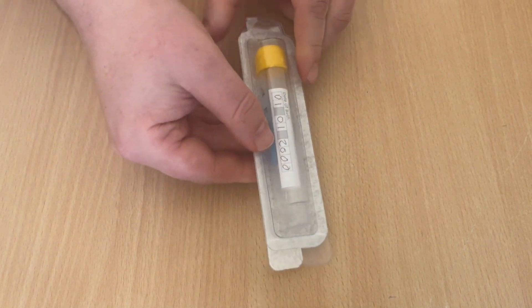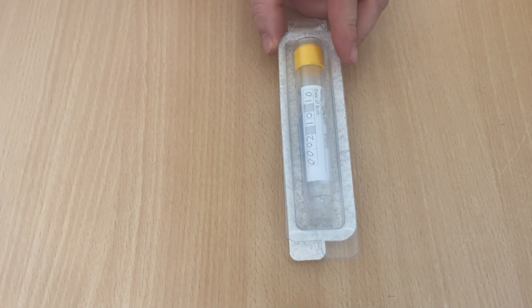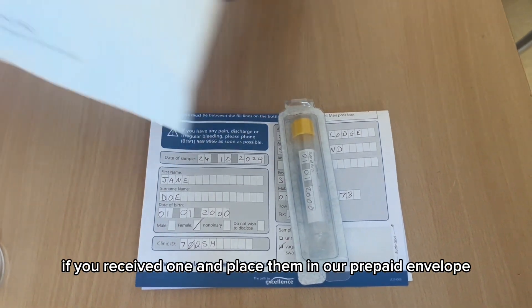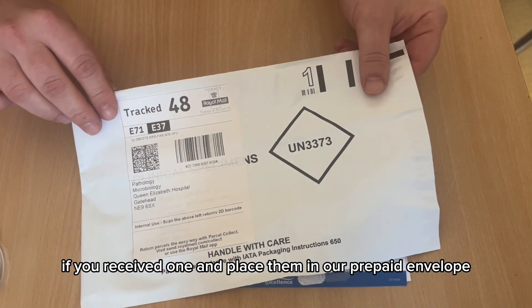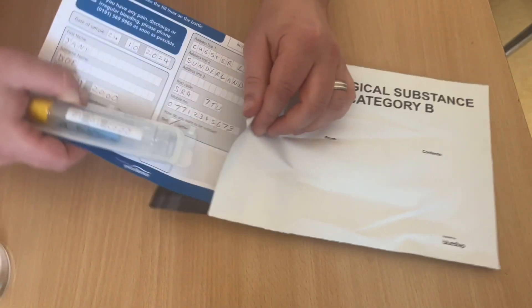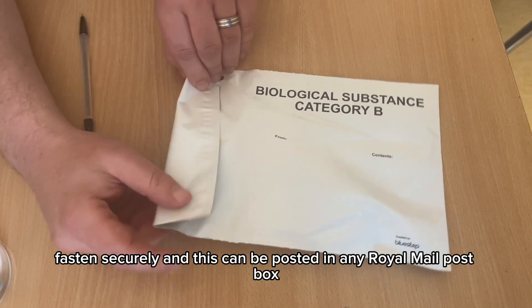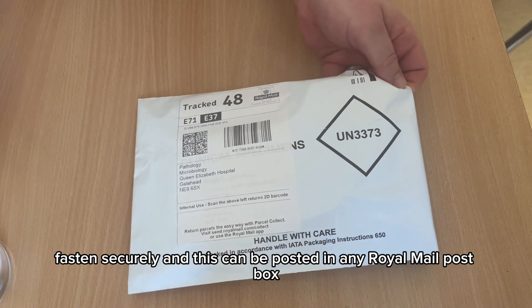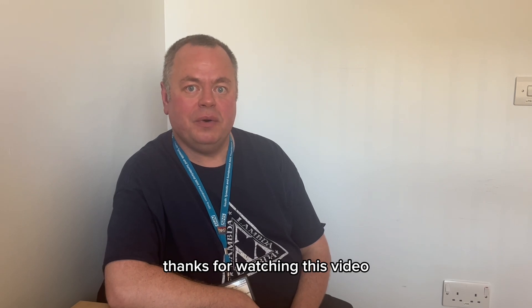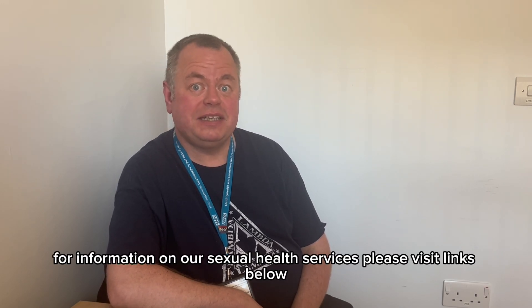Take your sample along with your testing form, if you received one, and place them into the prepaid envelope. Remove the seal, fasten securely, and this can be posted in any Royal Mail post box. For information on our sexual health services, please visit the links below.